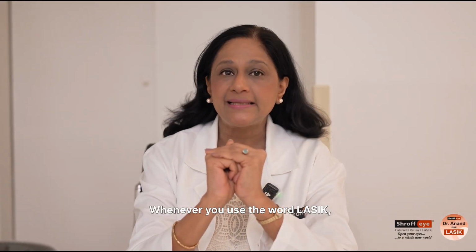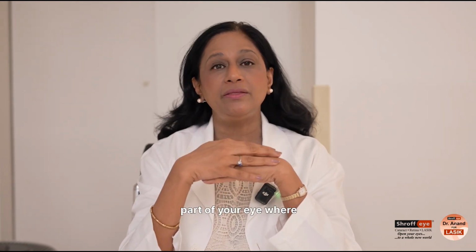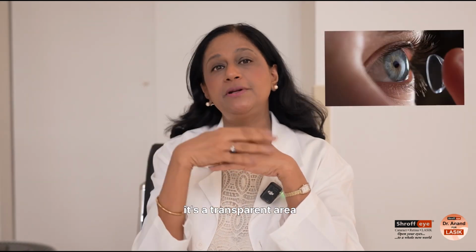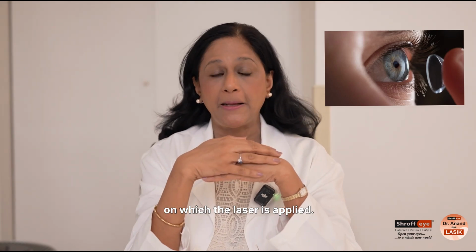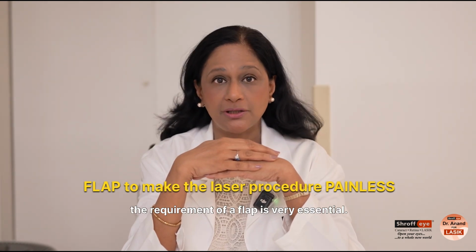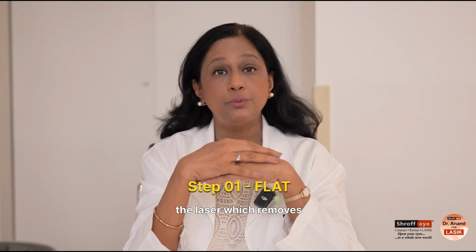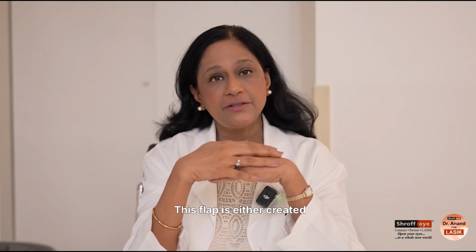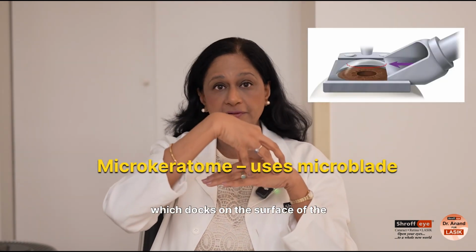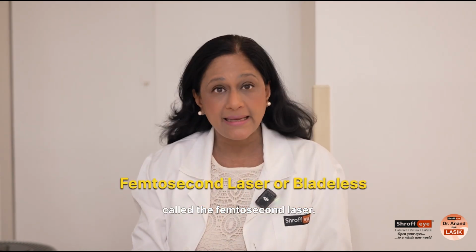Whenever you use the word LASIK, know this that it has what we call a corneal flap. The laser is done on that part of your eye where one sticks the contact lens. Typically the colored area, it's a transparent area on which the laser is applied. Now, to make it painless, the requirement of a flap is very essential. So, a flap is created prior to applying the laser which removes your spectacle powers. This flap is either created by use of a microkeratome which docks on the surface of the eye, or it is created with the help of a laser called the femtosecond laser.